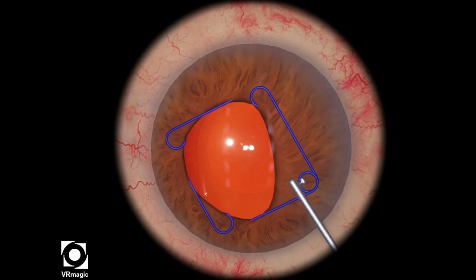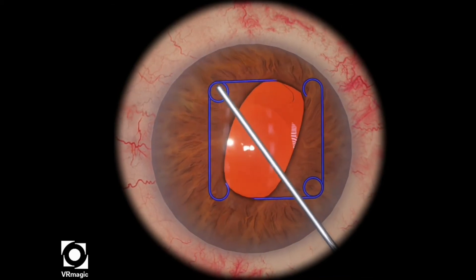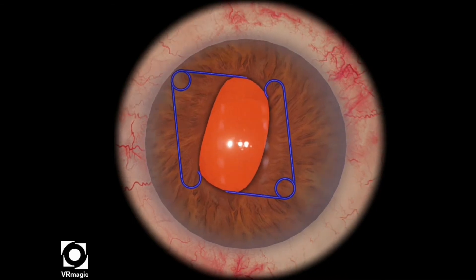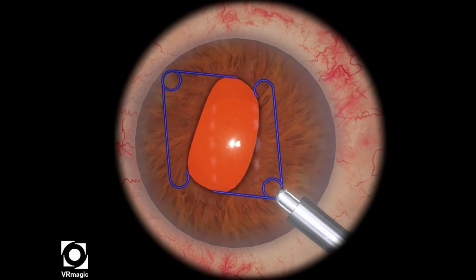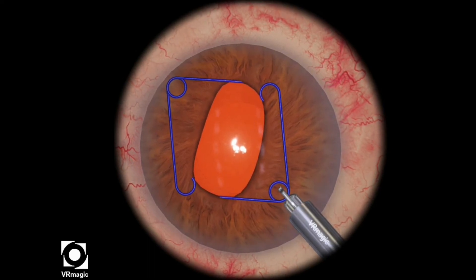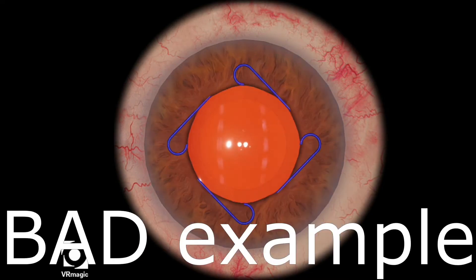I like to take out the proximal loop first, then go after the distal loop. The secret to this particular level is actually trying to position the Malyugin ring to the correct orientation, so that when you insert your loader or the Malyugin ring injector, you can actually easily retract it back into position. That's why I go after the proximal one first — once you get into the right position, it just slides easily into place.